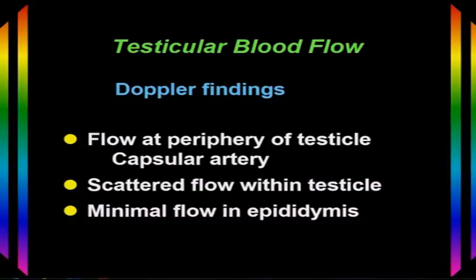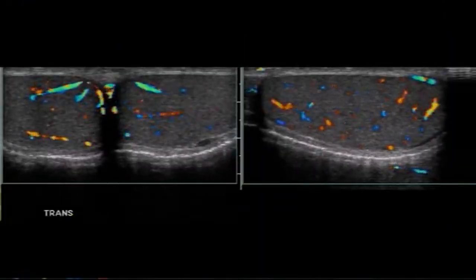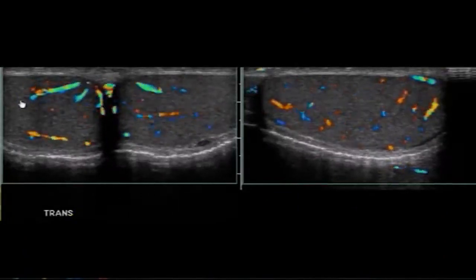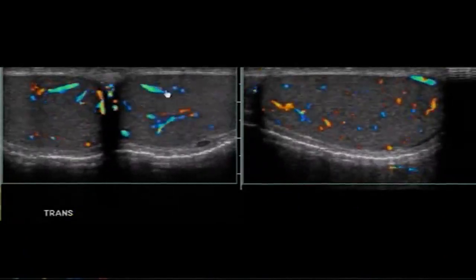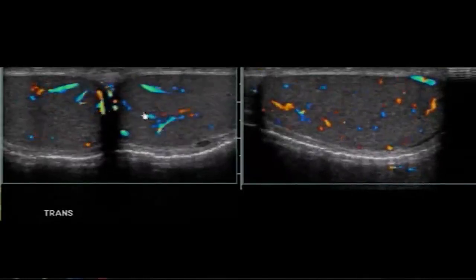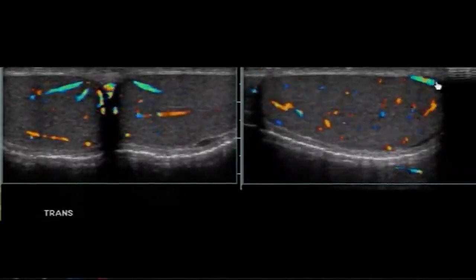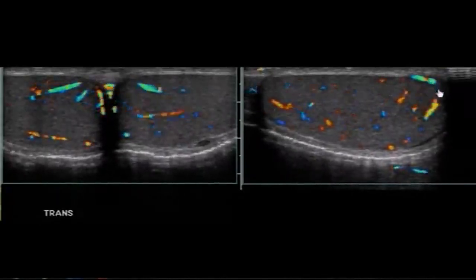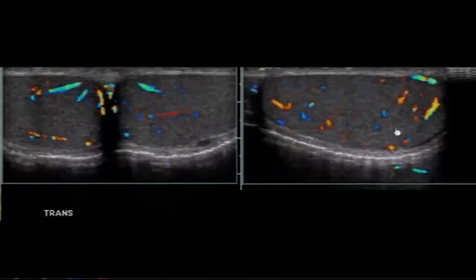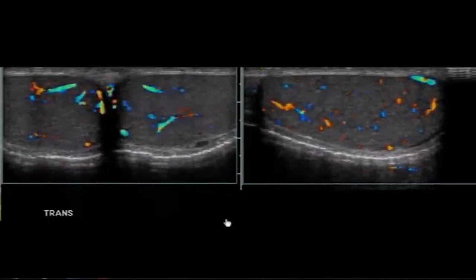Typically, we see minimal flow inside the epididymis — less than what's seen inside the testicle. On a transverse view of the scrotum, we can see both testicles with blood flow scattered throughout the testicular parenchyma. On the longitudinal view, we can see the capsular artery as well as blood flow inside and scattered throughout the testicular parenchyma.